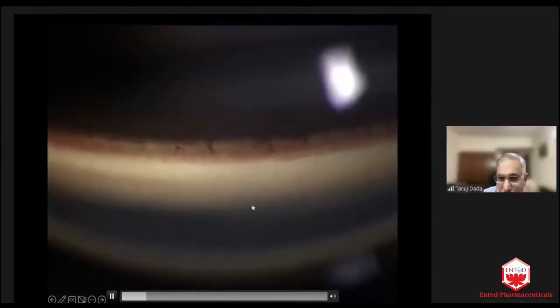So this is very important. Now, this is a very important gonio video we captured. Normally you don't see this. These are irregular vessels crossing the scleral spur, arborizing on the trabecular meshwork. It is very important that when we see an ischemic CRVO or PDR patient, we do undilated gonioscopy. Most retina people will dilate and call the patient, and this is what is missed. So now this patient is detected at an open angle stage. If you see this, immediately panretinal photocoagulation has to be done. This is a very important sign. If you wait a few weeks, this will become complete angle closure.